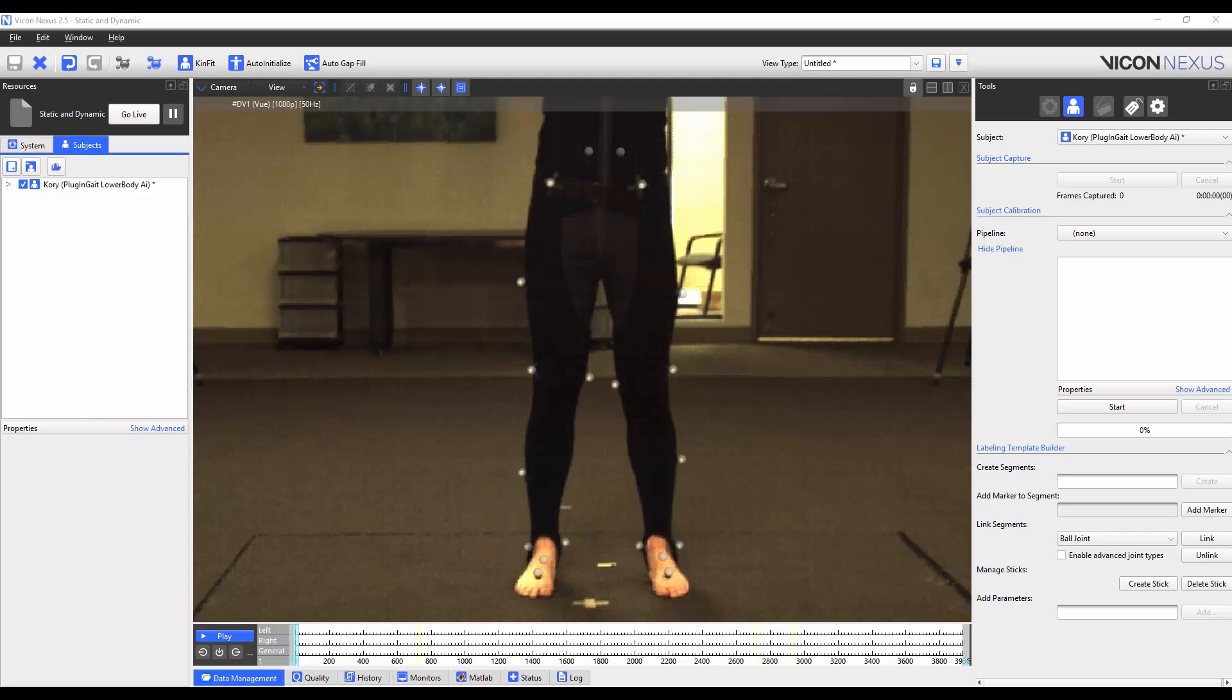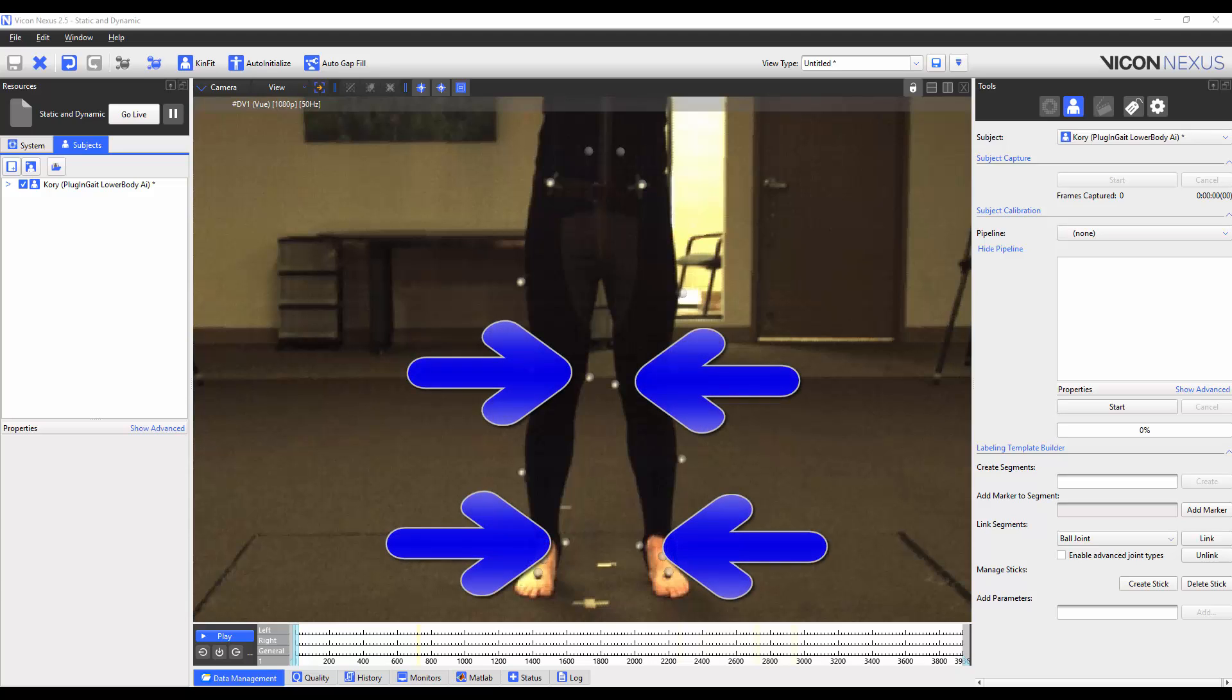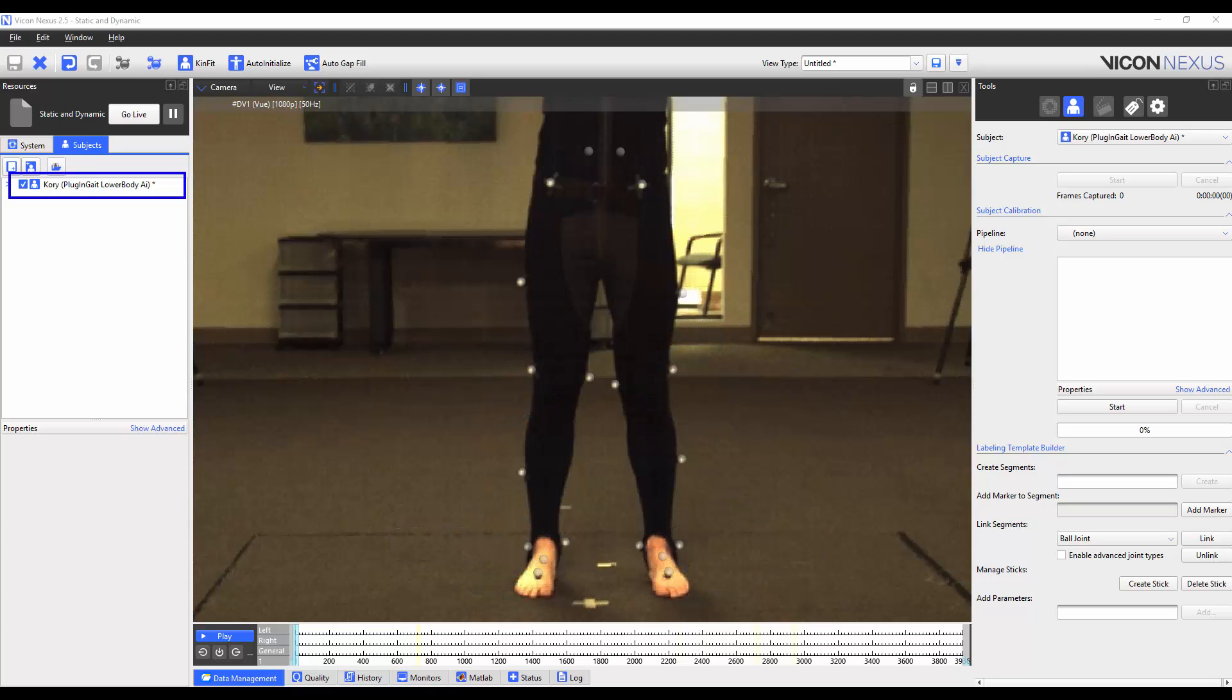Welcome to the Nexus 2 help guide. In this video we're going to show you how to add extra markers to a plug-and-gate model. We'll be adding medial ankle and knee markers to the plug-and-gate lower body model. You can use the same principles in this video to add more markers such as marker clusters to other plug-and-gate models as well, such as the full-body plug-and-gate model.